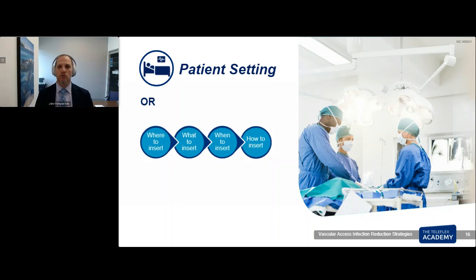Because what we don't want to do is receive the patient in the ICU and have to change the central line that was placed in the OR to something more. Because that's now introducing an exceptional amount of increased risk to the patient. Remember, you can also use an IO in the OR. They're incredibly effective for resuscitation.